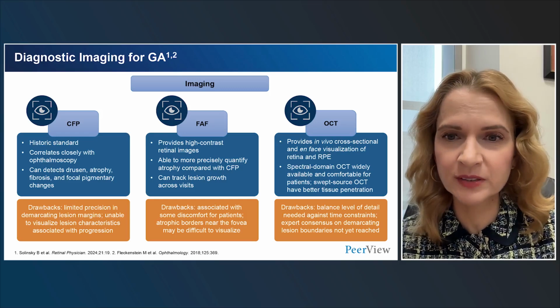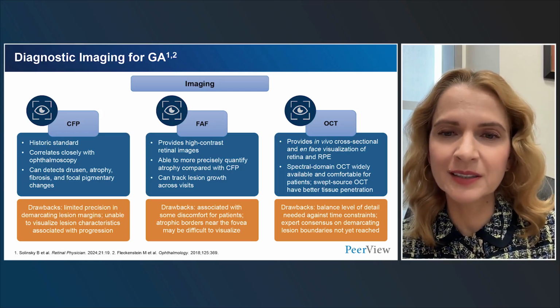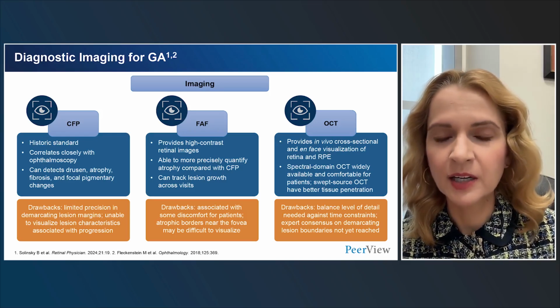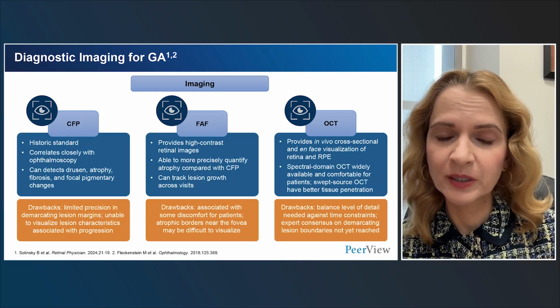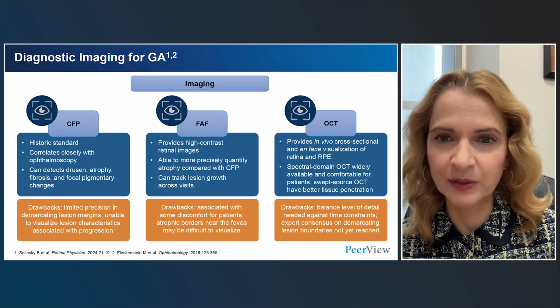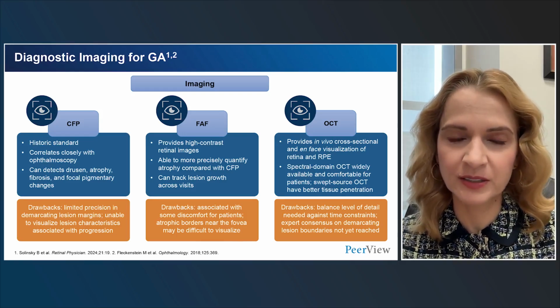The drawbacks of this technology are that we need to balance the level of detail needed against time constraints. High resolution imaging is more time consuming. There needs to be further development of expert consensus on demarcating lesion boundaries. This has not been reached yet, and a lot of work is in process.